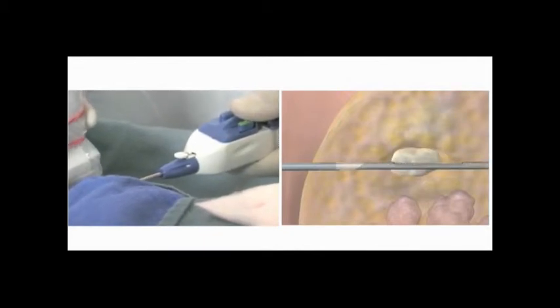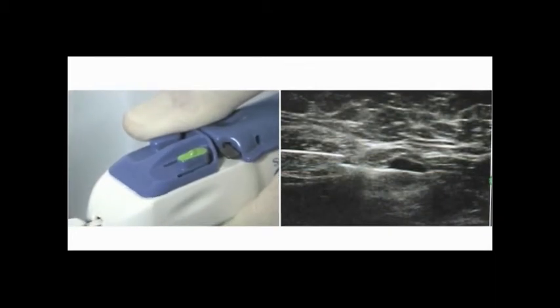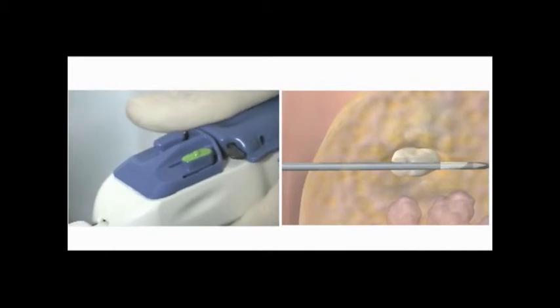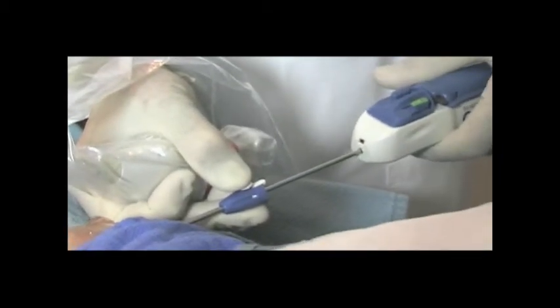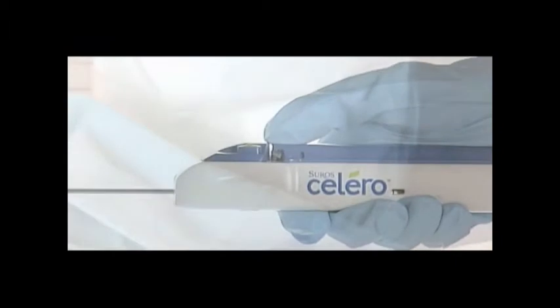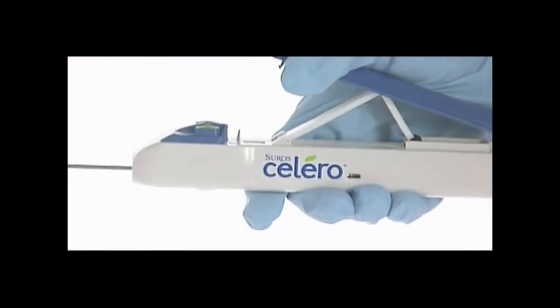The needle will advance 25 millimeters. Confirm the open aperture is in correct placement on the ultrasound image. To begin tissue acquisition, press the blue button on the top of the Celero handpiece. Once you acquire the tissue sample, leave the introducer sheath in place and detach the Celero needle from the hub by pressing the white latch. Remove the needle from the breast. Release the Celero actuating lever by depressing the black latch located on the top left side of the device.